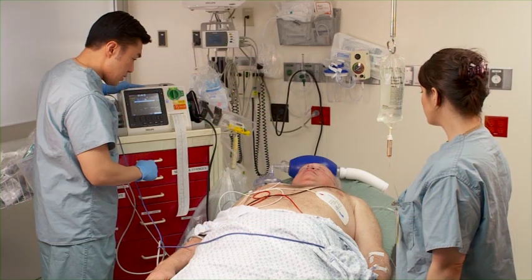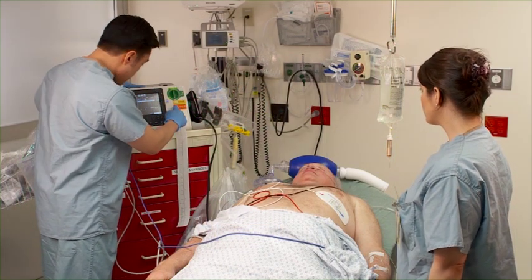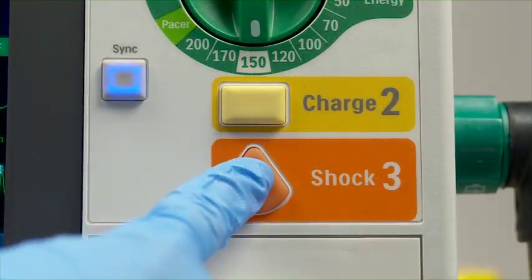Press the charge button on the XL Plus. Make sure no one is touching the patient or anything connected to the patient. Press and hold the shock button on the XL Plus — a shock delivers on the next detected R wave.